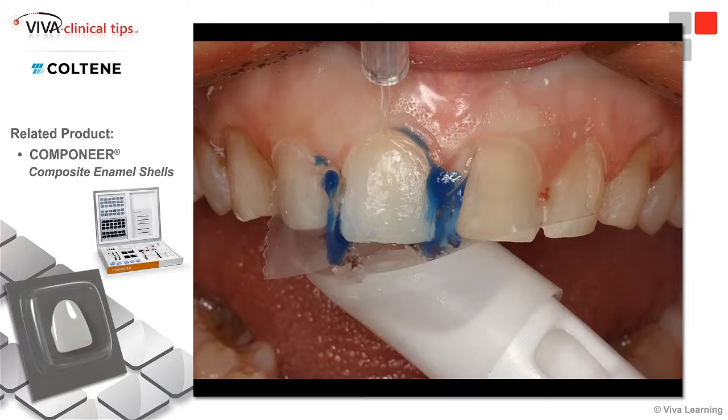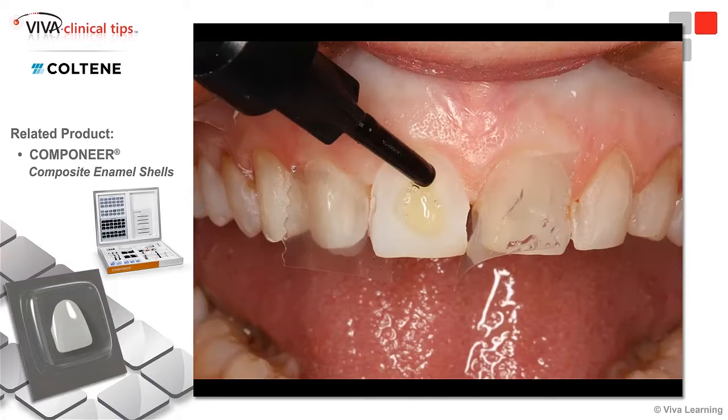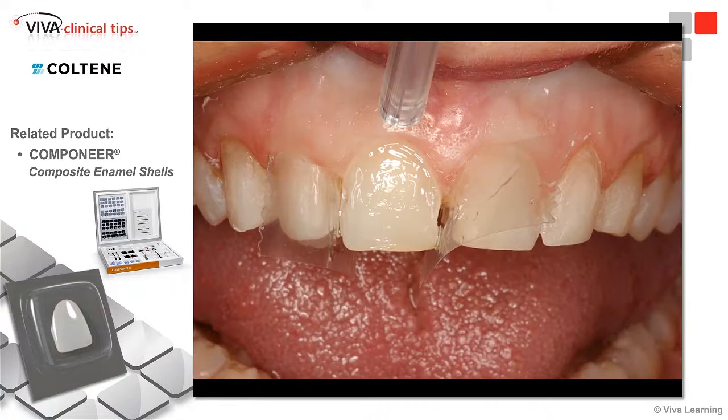Just 10 seconds with phosphoric etch, and you can see that it's being rinsed off, and there's that beautiful etched enamel surface that we love to see and we know is very, very bondable. Then I'm going to place a bonding agent. This is Coltene's bonding agent. One coat bond by Coltene. And we're going to massage that in for about 20 seconds and then blow it thin, getting rid of the alcohol or acetone carrier, whatever's in bonding agents, and leaving only the resin.